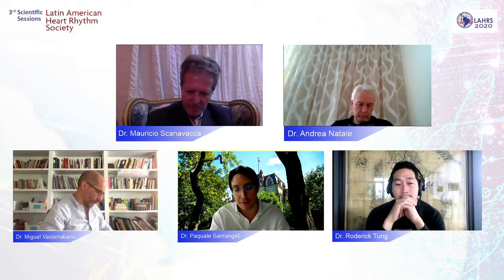Yes, between the right and the left, of course, if you stay away from the septum, that's the epicardium, right? There may be some epicardial connection there. And it's possible. I showed the anatomical picture that shows those connections in the Waterston groove. Those are epicardial. They go from the epicardial right atrium, septal wall, to the epicardial left atrium. But even if we go epicardial, we won't be able to map those, in my opinion, because we are far away from where we can manipulate the catheters, because the oblique sinus stops at the pulmonary veins, and we cannot go beyond that.